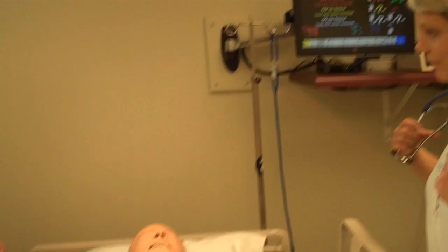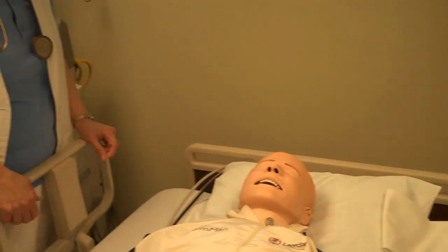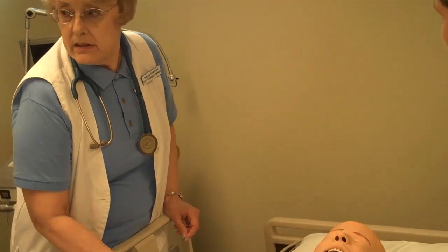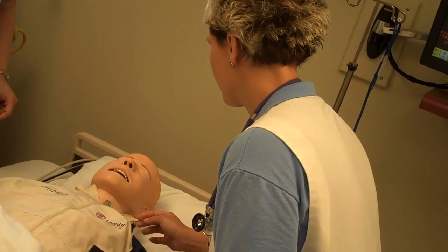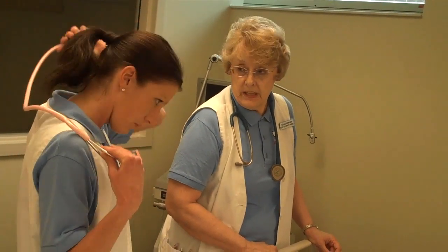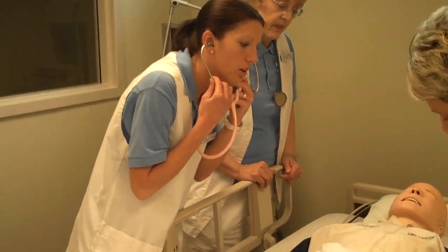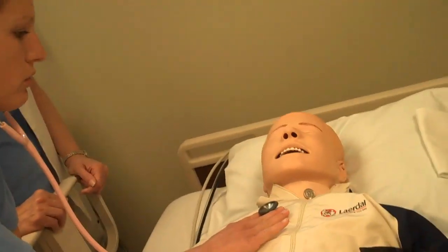'Hello, Mr. Brown. I'm Susan, I'm your nurse today. And this is Rebecca and I'm Crystal — we're going to be helping you out today. We hope to make you feel better.' 'Rebecca, would you like to go ahead and take Mr. Brown's vitals?' 'Sure, I'm going to start by taking some pulses.' 'I'm just going to take a listen to your heart, lung, and bowel sounds. Just go ahead and breathe normal.'